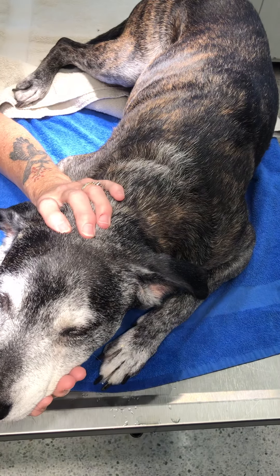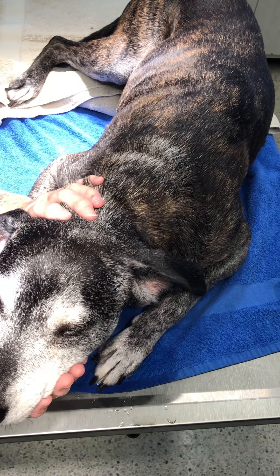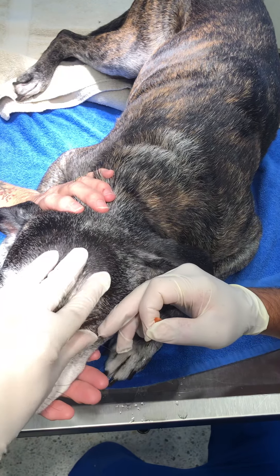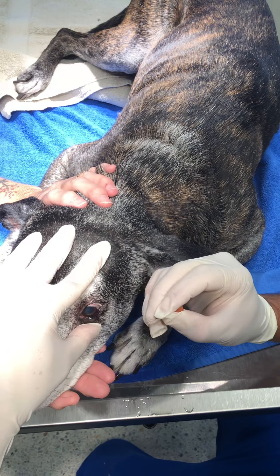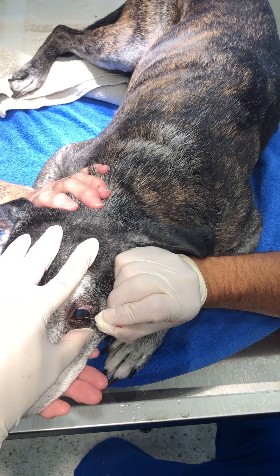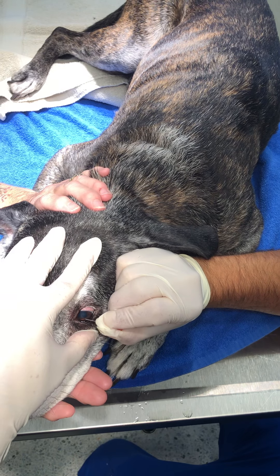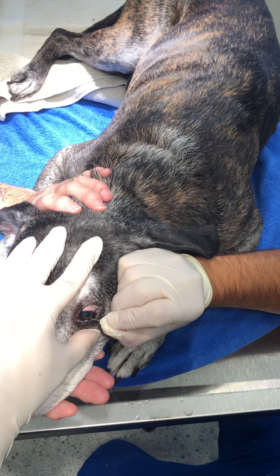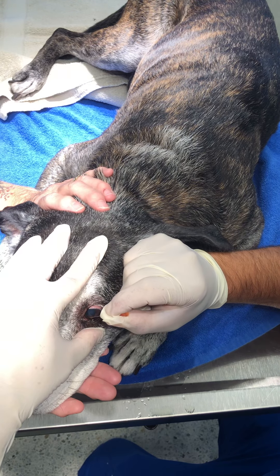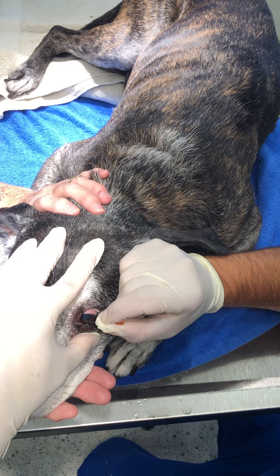Now with a 25-gauge needle we're going to perform the grid keratotomy. That involves making some scoring lines that extend a little bit beyond the ulcer margin. We're going to start from a little bit outside and make scoring lines about two to three millimeters apart, starting and finishing in healthy tissue.